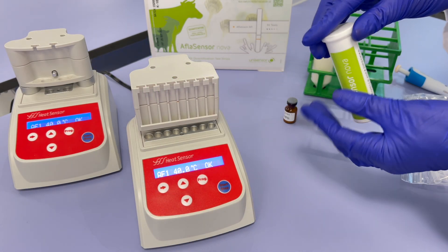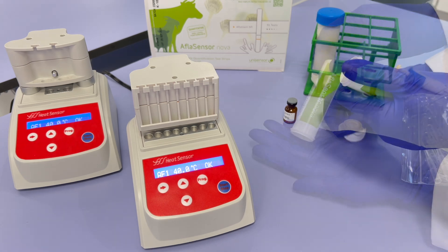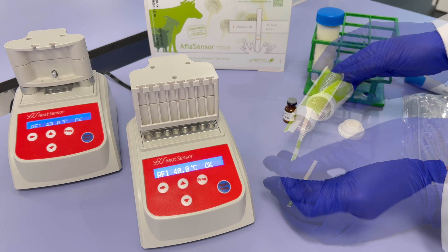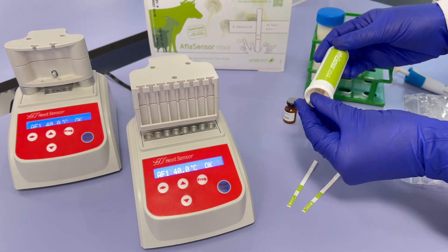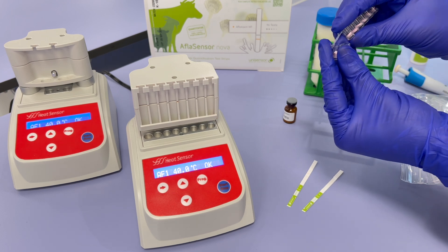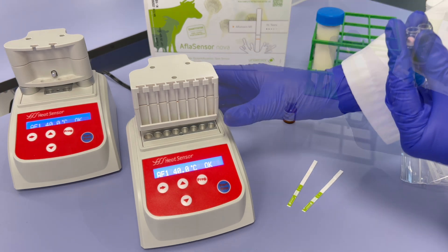Testing Procedure: Open a tube and take as many microwells as there are milk samples to be tested. Be sure to empty one tube before opening another. Make sure the tube is at room temperature before opening it. Take care to leave the protective film on the unused microwells.